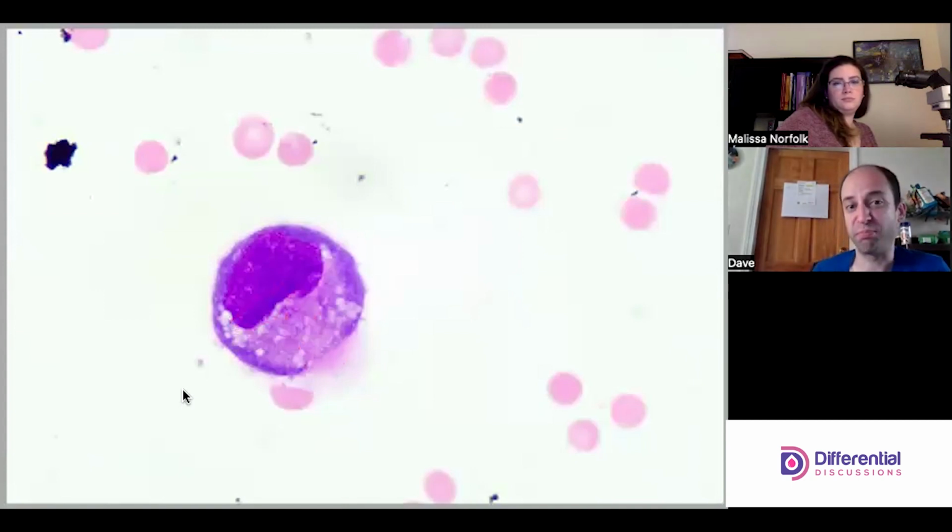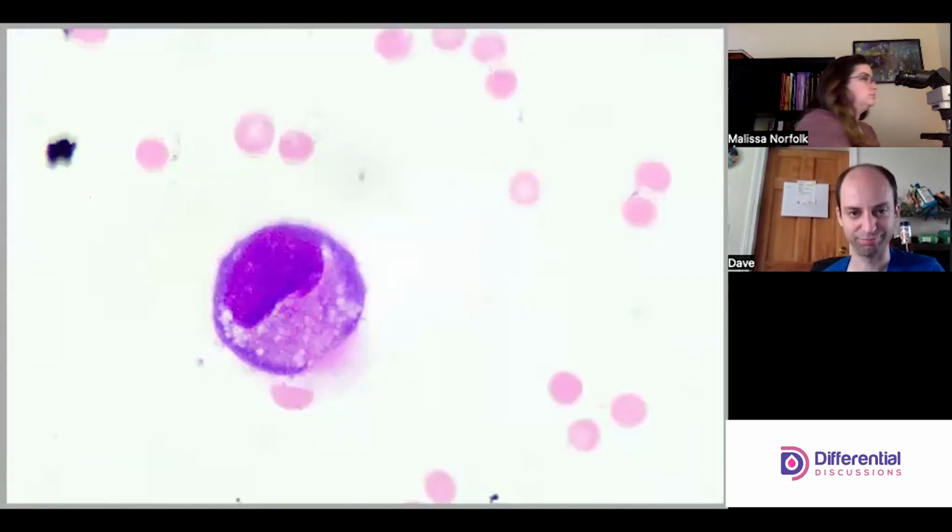We have weird shaped nucleoli that are maybe tiny. The nuclear margins, what the heck is this little thing sitting there? So I'm putting this fella in other as well. And it's huge again.